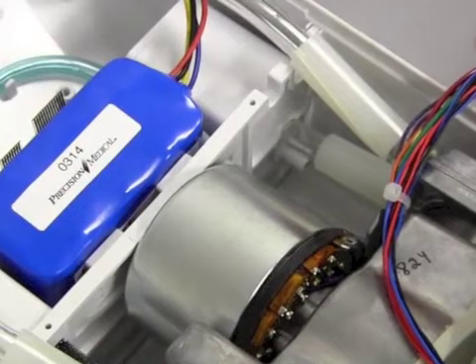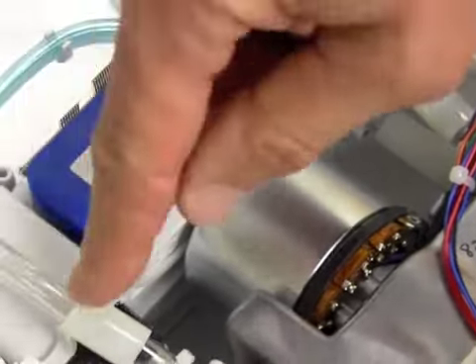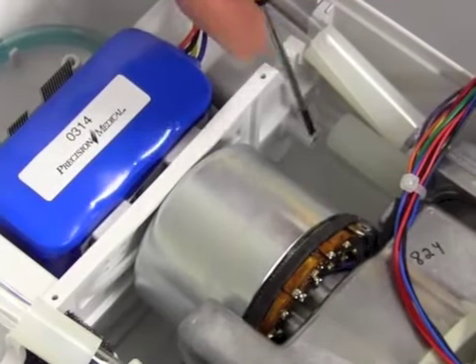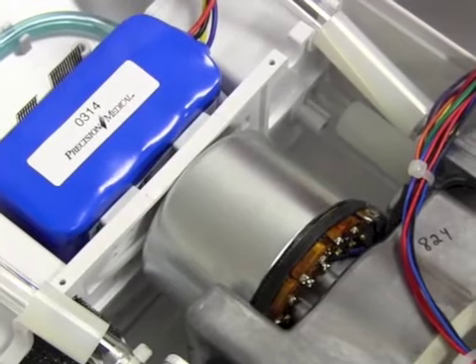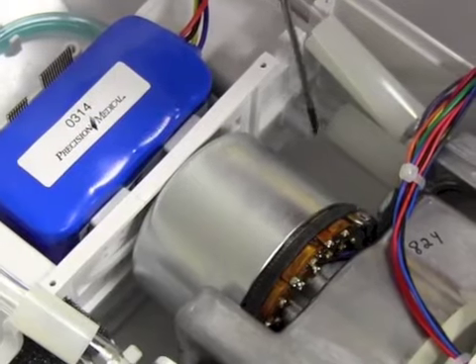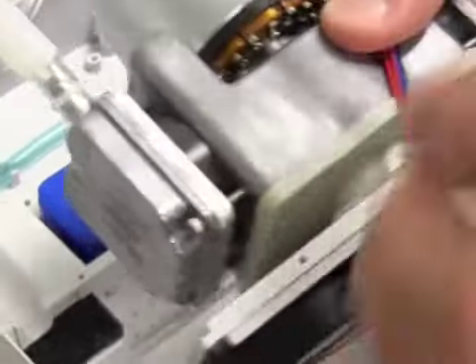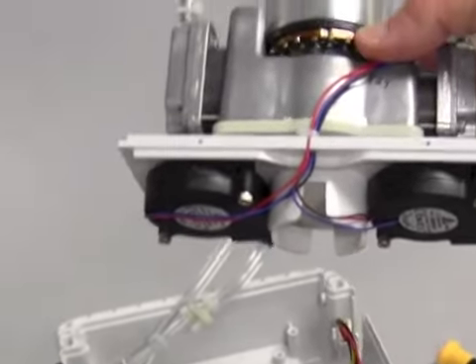When you're removing the compressor from the POC, you have to pull the Tygon out of the slots. And you also will have to pry the lower Tygon tubing off of the nipple that goes into the reservoir. So the best thing to do is use a flat blade screwdriver like I have in my hand to gently move the Tygon away from the nipple, and then you're ready to pull the compressor assembly upward, and it will come out of the unit as a complete assembly with the fans attached on the bottom.